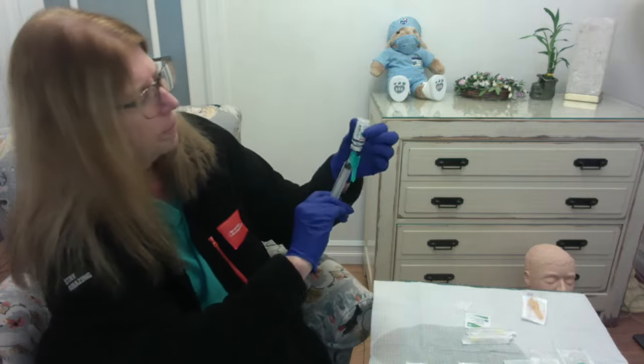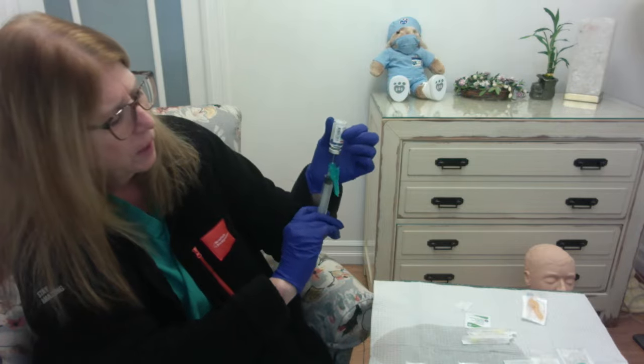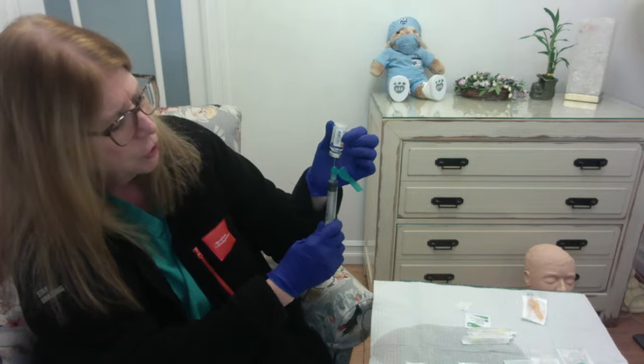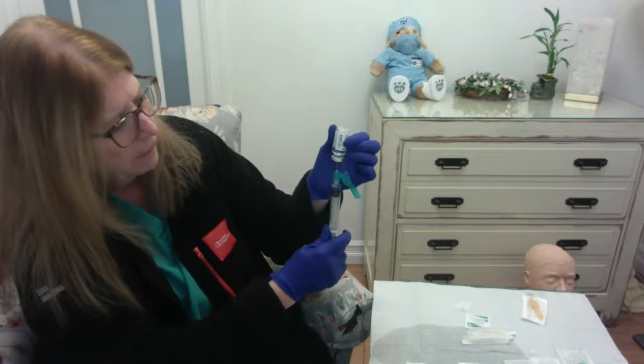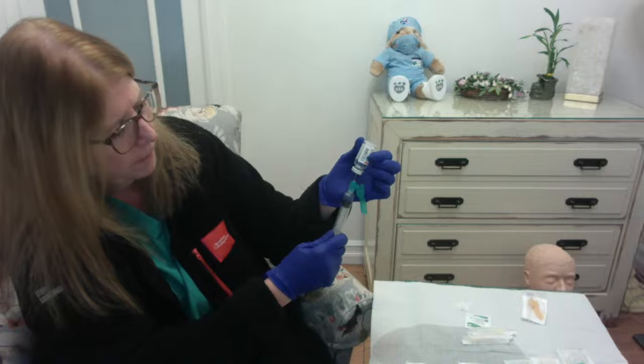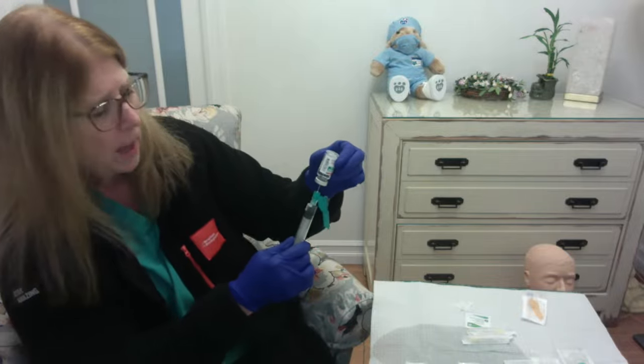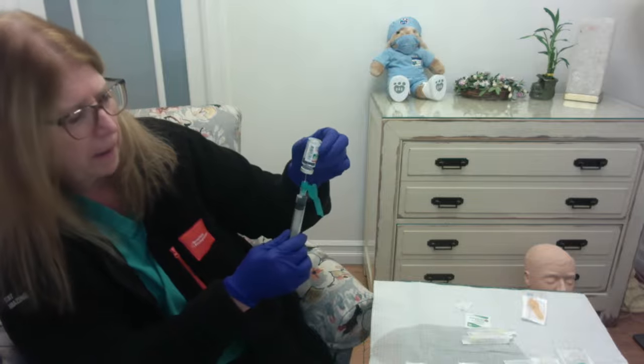I'm going to flip, get that window facing me, get the needle below the level of the fluid. I'm going to let that plunger come on back, and then I'm going to give it a little help. Okay? And I want to get to the 2 milliliter mark. And this actually is perfect because I have a big fat air bubble, and I want to show you what we're going to do about air bubbles.